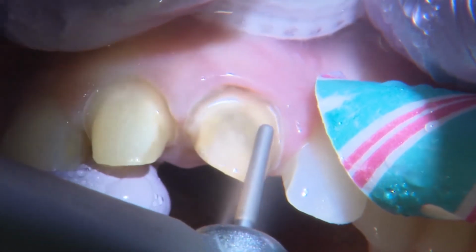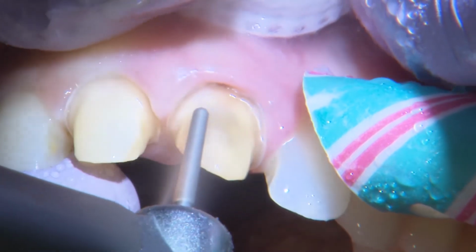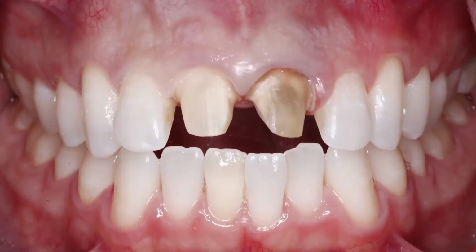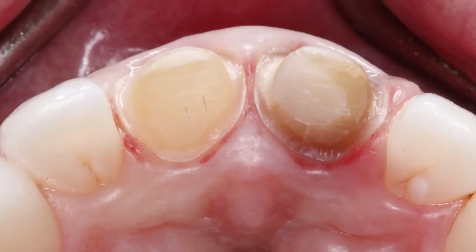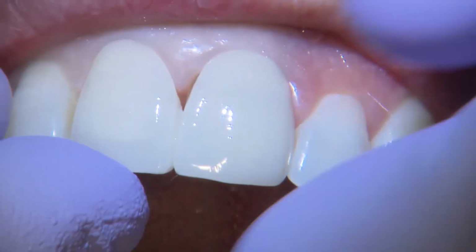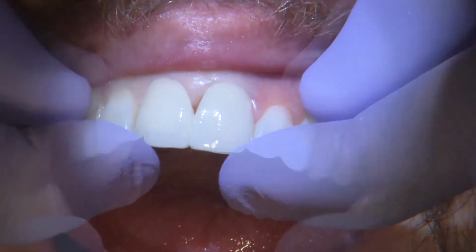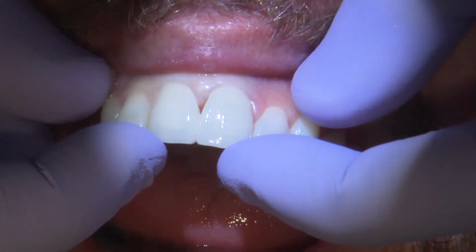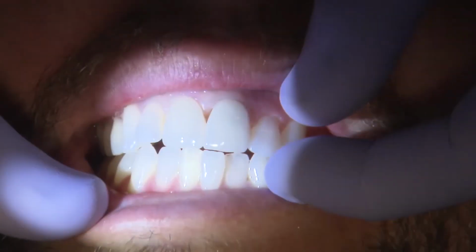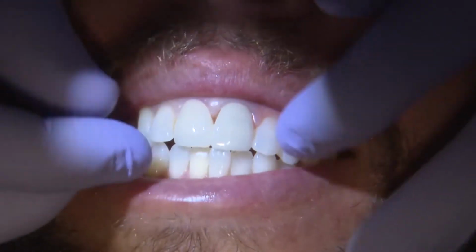Now, this is the step where I like to evaluate the teeth. Once again, I remove the final restorations, and you can tell that tooth number 9 has a darker dentin shade than tooth number 8. And at this stage, I can go ahead and select the restorative material. I had a good idea going into it because I already knew that the tooth was root canal treated, and removing them will also help me evaluate. Regardless, what I want to do now is fit the BioTemps, and this is the BioTemps CAD product.